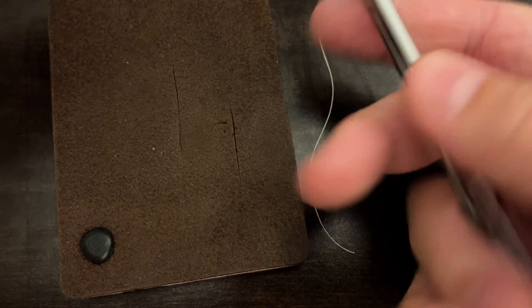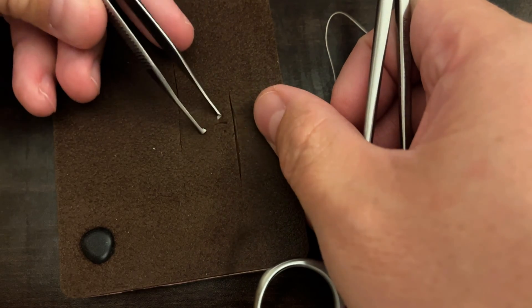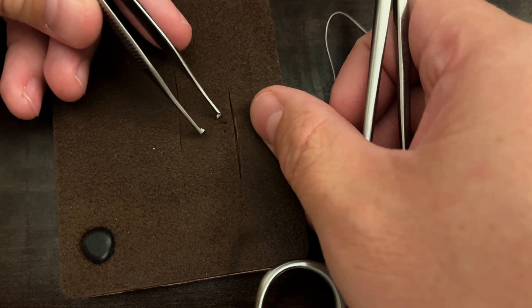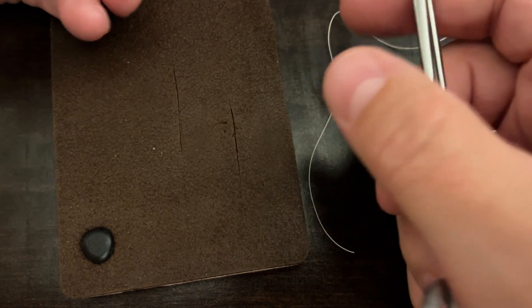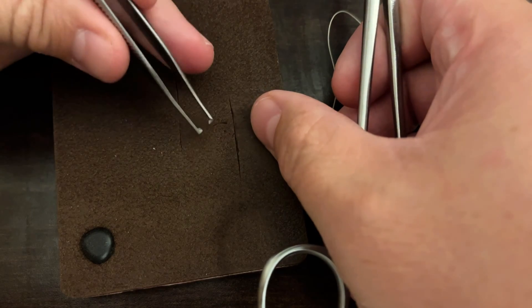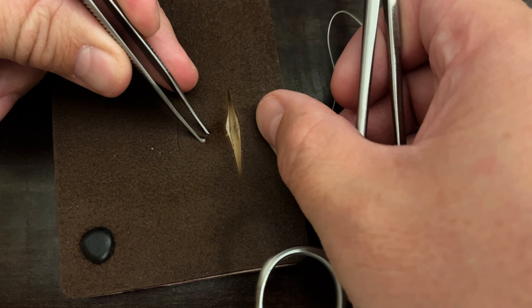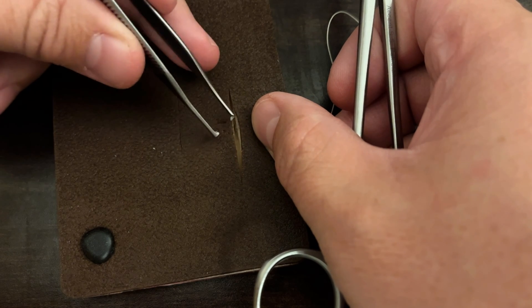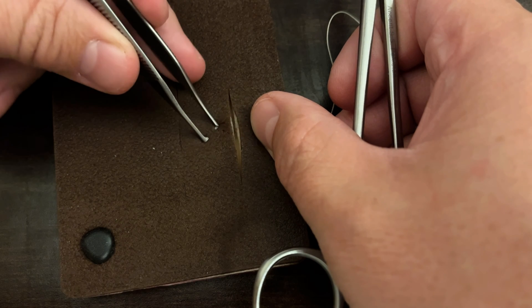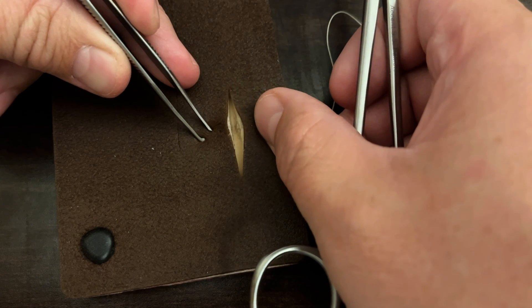One of the hopes with subcuticular suturing is to minimize scarring. I've used this method in the past oftentimes on the face to close a laceration on the forehead, sometimes closing after a temporal artery biopsy, or closing the neck after a carotid endarterectomy, or an anterior cervical discectomy and fusion — closing the skin in a subcuticular fashion oftentimes with steri-strips over the top.